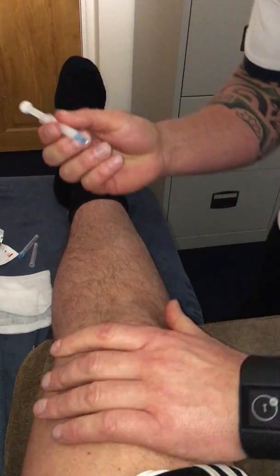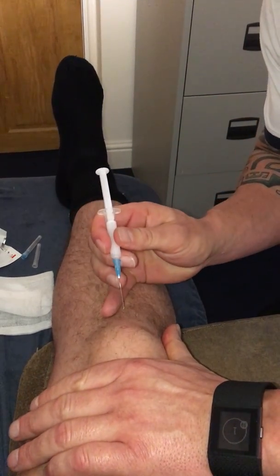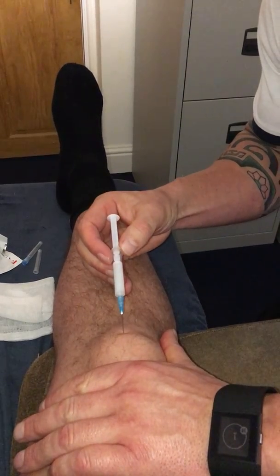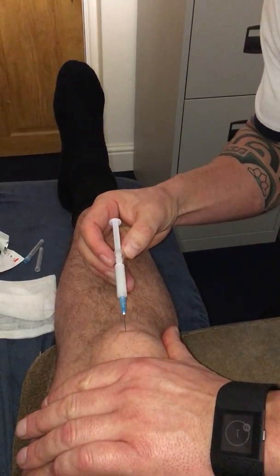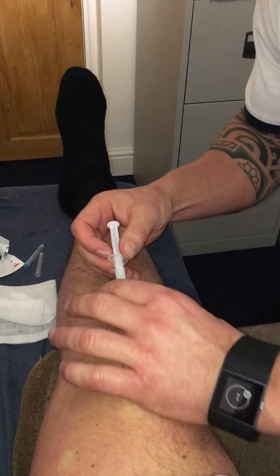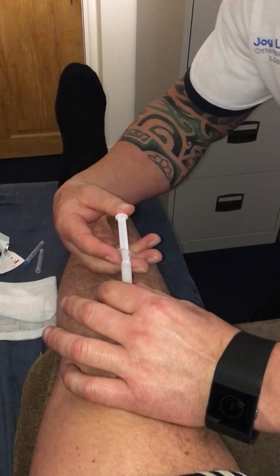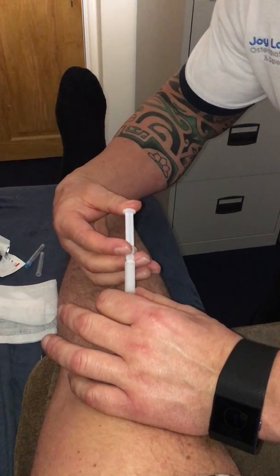Tilt the patella, push up into the roof. We're in. We aspirate to be sure we're not in a blood vessel, then we inject. We pepper around the tendon.